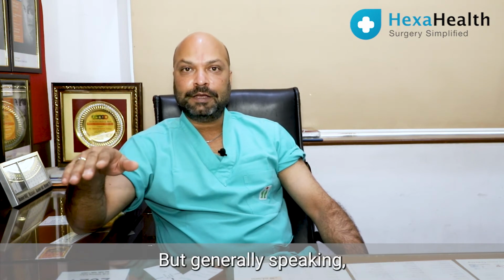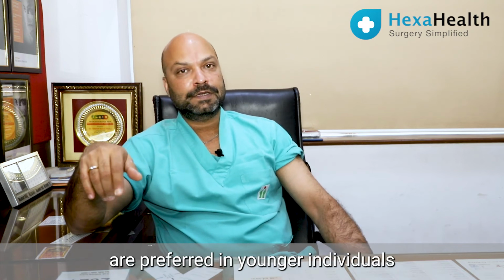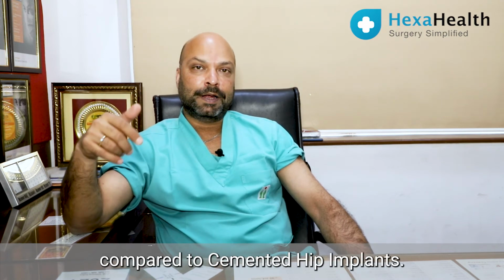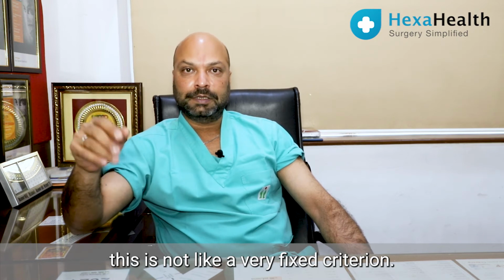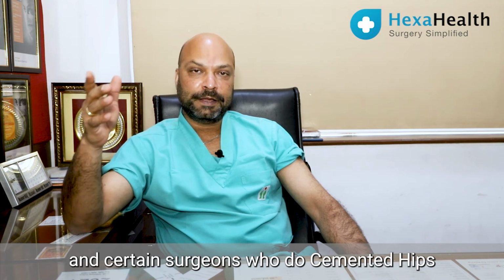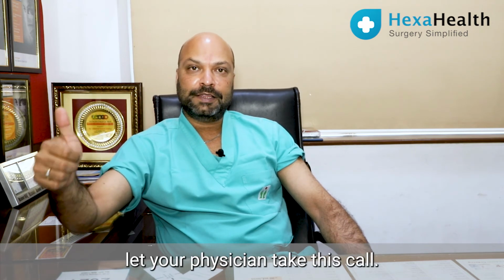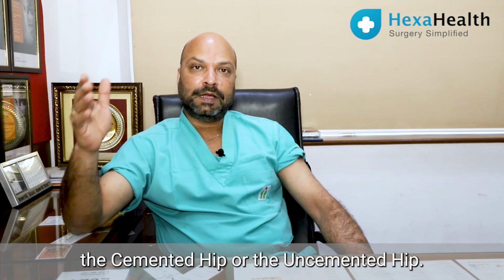But generally speaking, uncemented total hip implants are preferred in younger individuals because it is thought that the longevity of uncemented hip implants is more as compared to cemented hip implants. But again, this is not a very fixed criterion. There are certain centers and certain surgeons who do cemented hips in young patients also. So let your surgeon, let your physician take this call. Let him decide what would be best for you, the cemented hip or the uncemented hip.